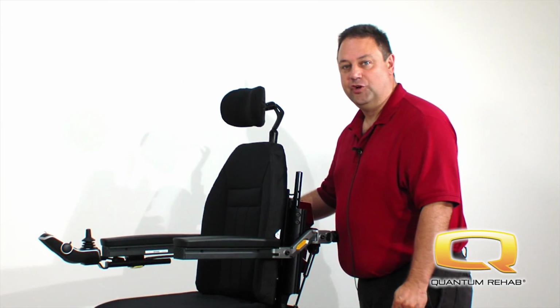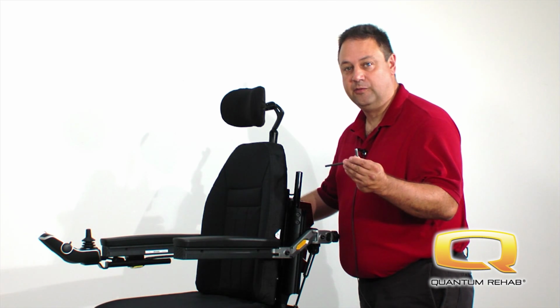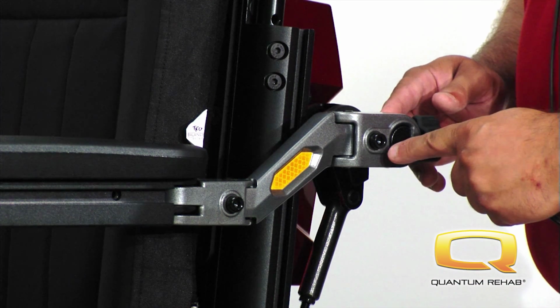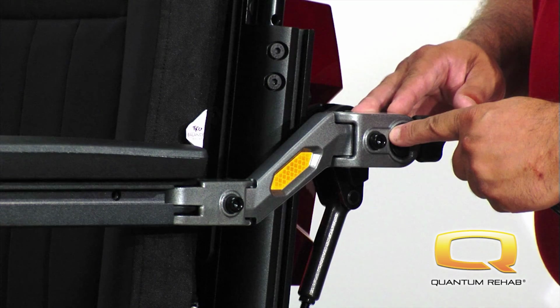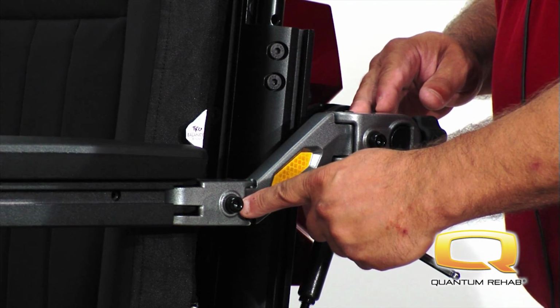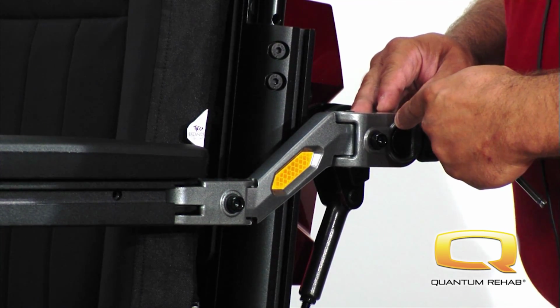Now I would like to talk to you about arm width adjustment. To do arm width adjustment, you need a 6mm Allen key. As you can see, there are 2 points to do arm width adjustment. Location number 1 is located at the outer part of the arm, and location number 2 is located right where the patient sits. Both adjustments can be done with the patient in the chair.